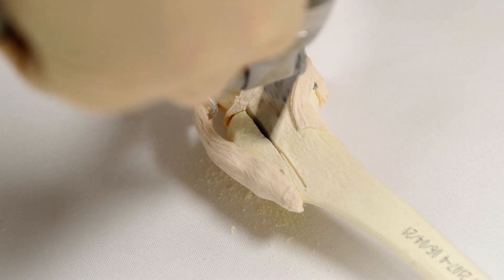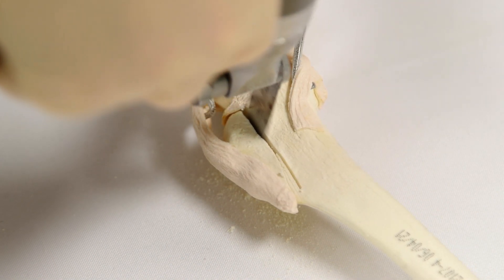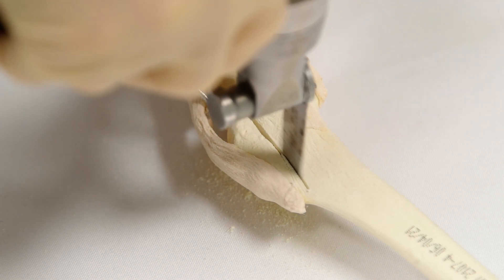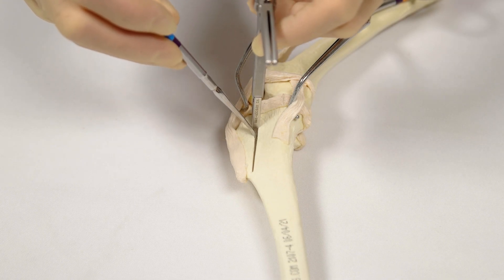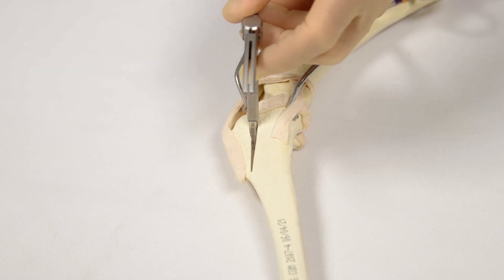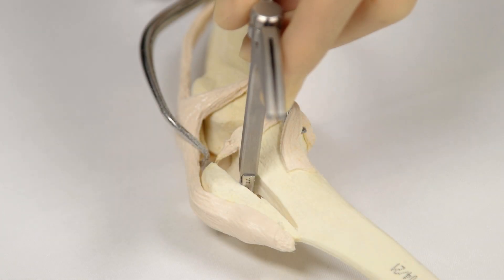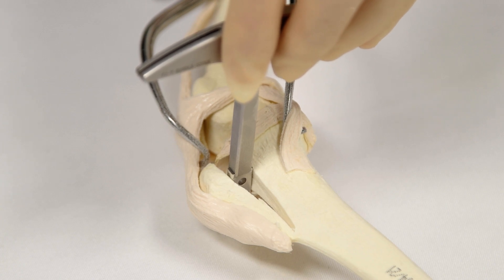The osteotomy is made bicortical along its entire length, but ensure that the distal tibia cortex and periosteum are left intact. The appropriately sized spreader is inserted proximally into the osteotomy to advance the tibial tuberosity according to the preoperative calculation of the required advancement. This must be done slowly and carefully to avoid fracture of the tibial cortex at the distal end of the osteotomy.